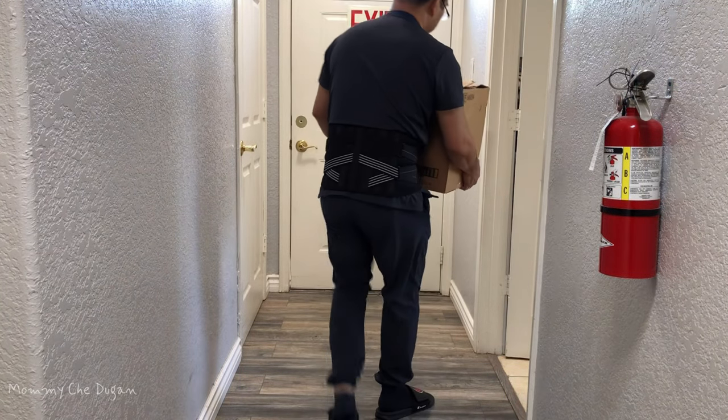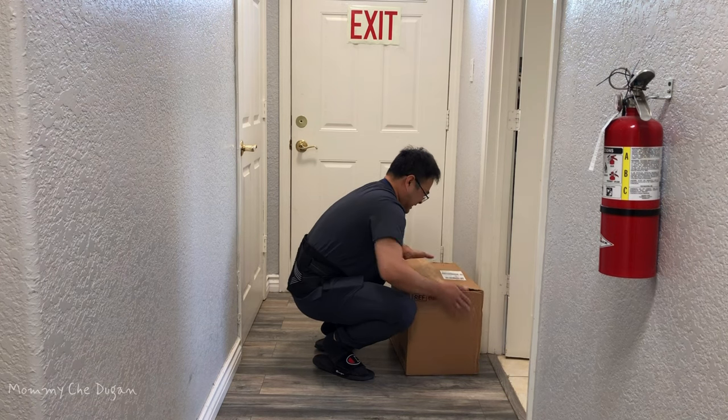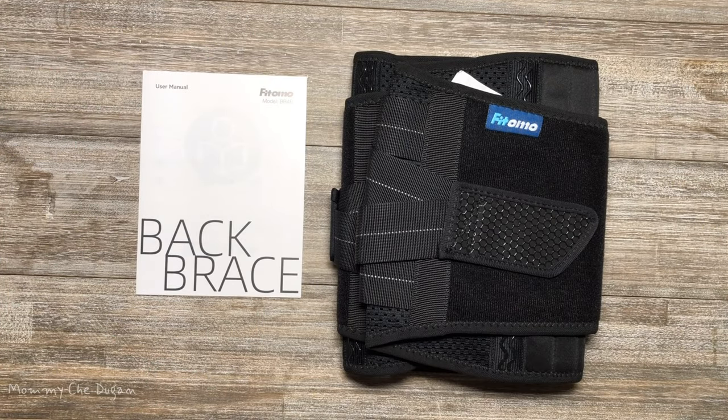This is a back brace for lower back pain for men and women. Inside the box are the following: back brace and user's manual.